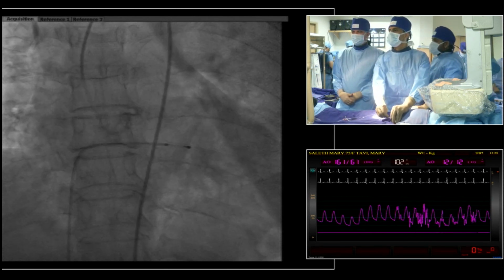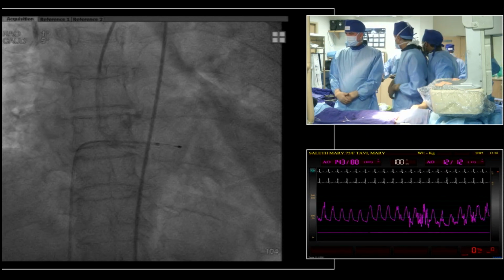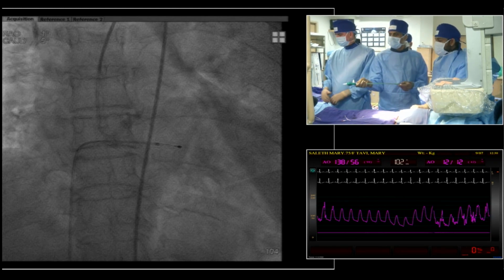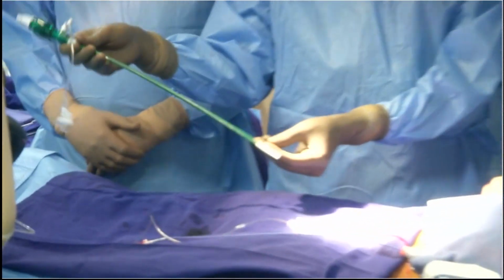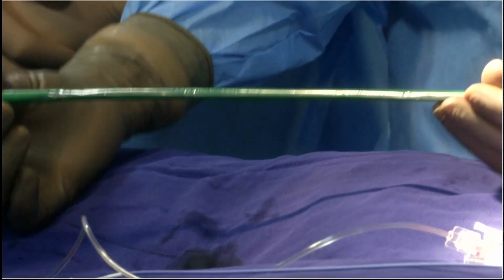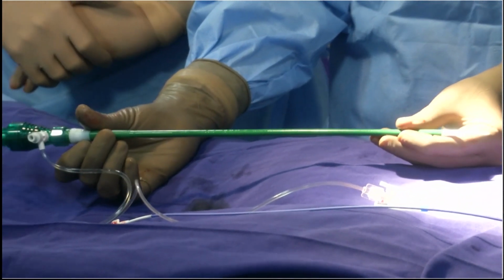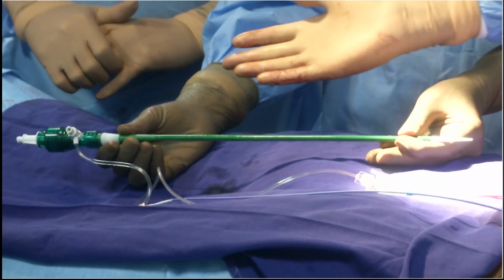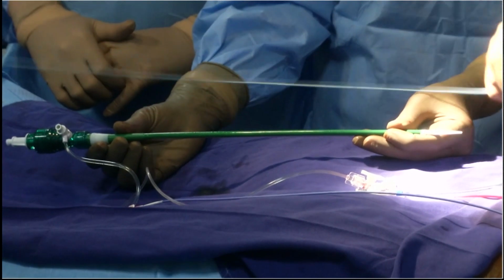The pigtail is right now in the non-coronary cusp, which we would like to have, at least at the time of deployment. In the case of a bad coplanar view, we usually use the follow the right cusp rule. Do you have the slide for the follow the right cusp rule? That means if the cusp is a little bit higher, we go cranial to fix the angle.